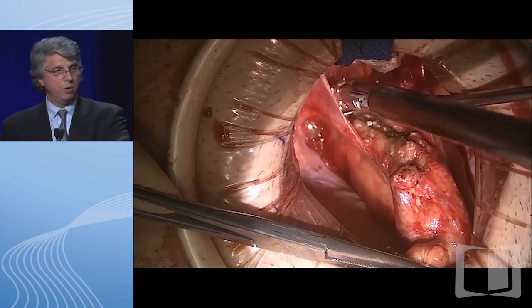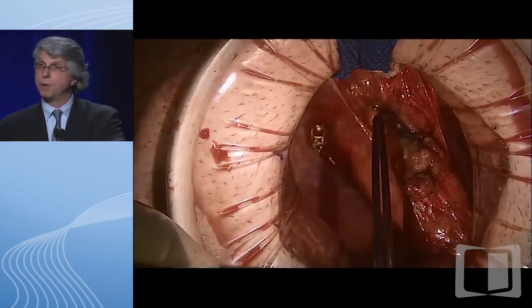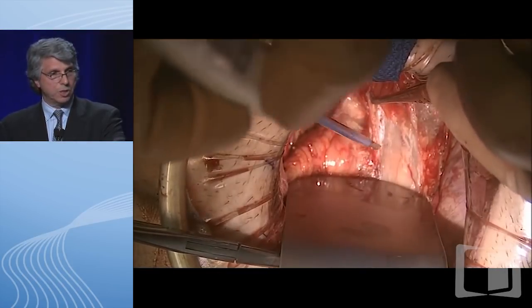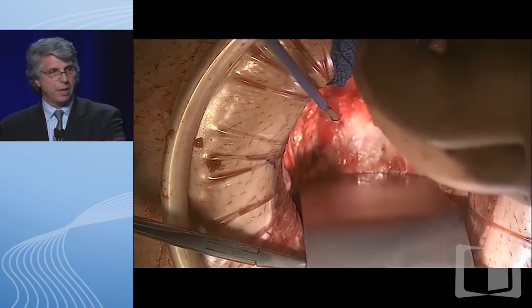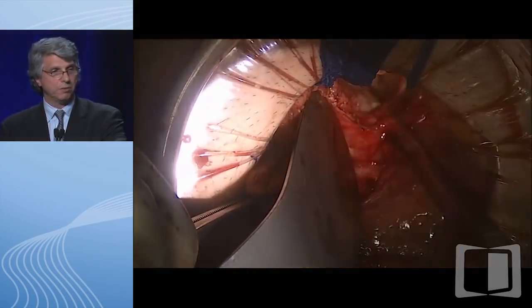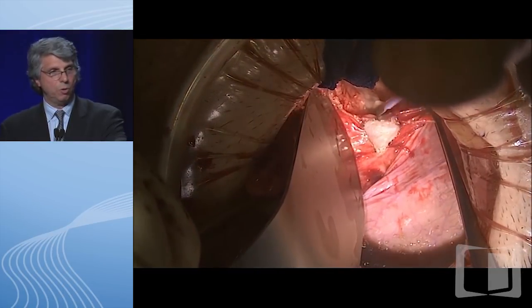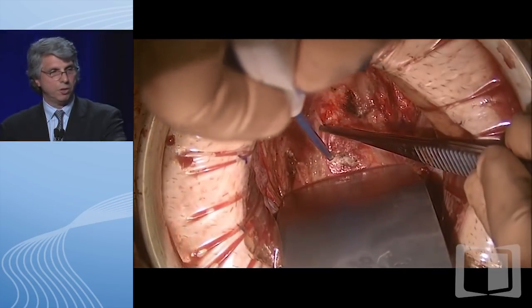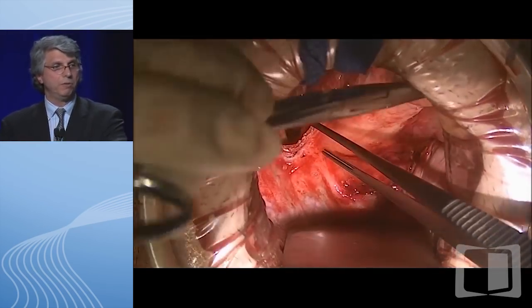We continue this dissection down—I'll show you the nice plane in a second. You can see there's a nice plane there with a little fat plane on the inferior border with a small blood vessel crossing it. That's the mesorectum, and if you're actually in the correct plane, there's very little if any blood loss—it's essentially a bloodless anatomic plane. All of us as colorectal surgeons know this plane very well. It's very important to stay in it, and it also reduces the incidence of genitourinary dysfunction. We continue the dissection down all the way to the pelvis.